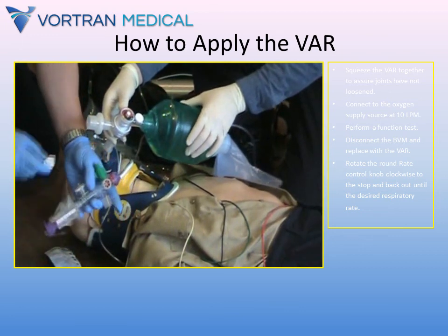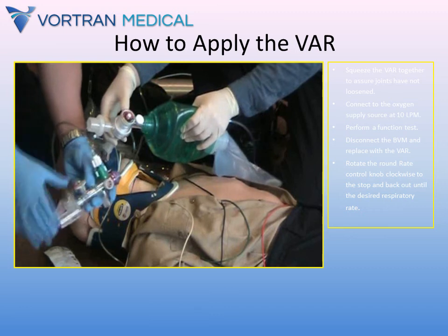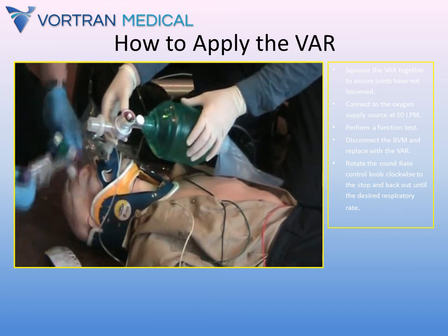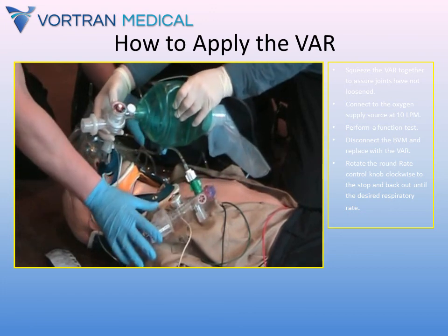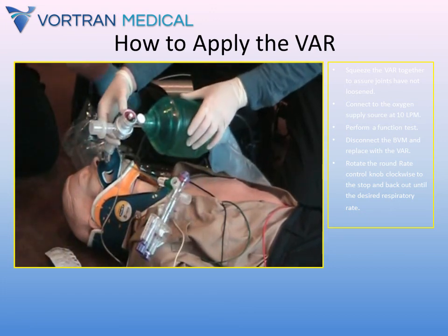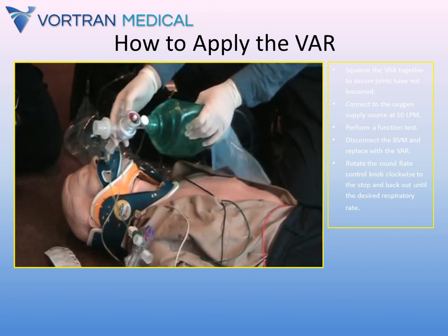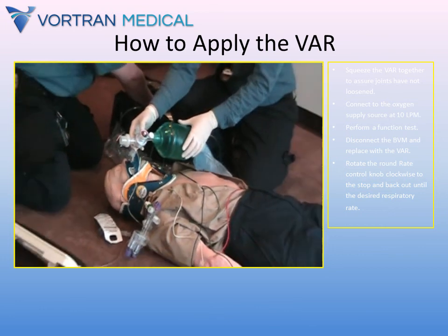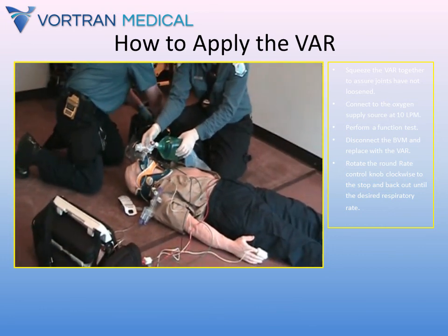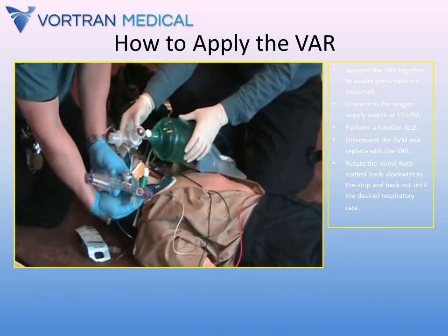VAR is tight. Alright, disconnect the bag valve mask oxygen and turn it down to 10 liters a minute. VAR. We'll test if it's cycling.